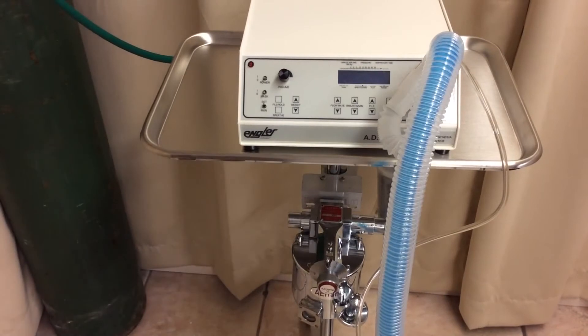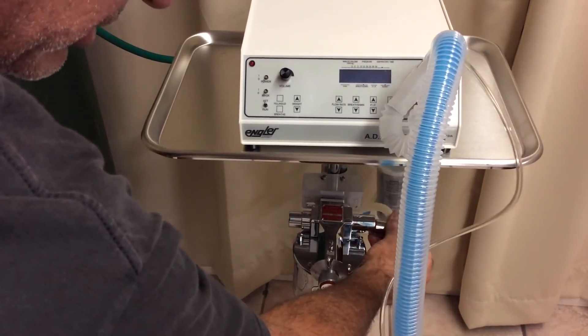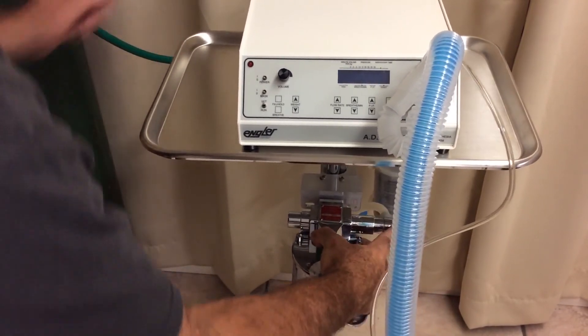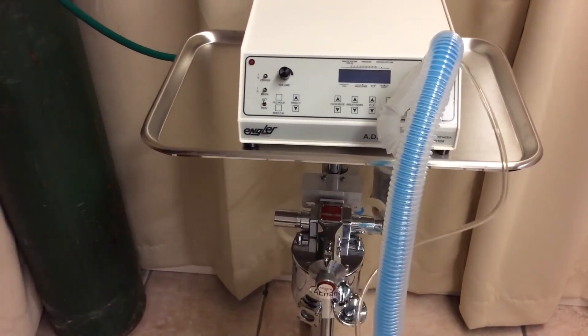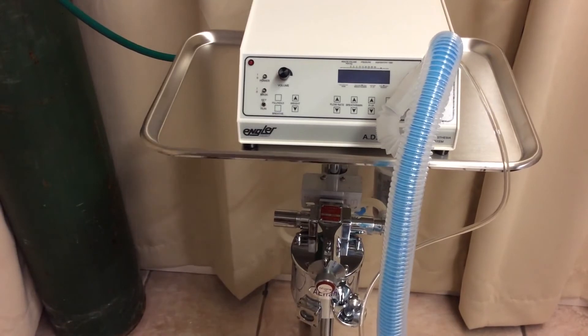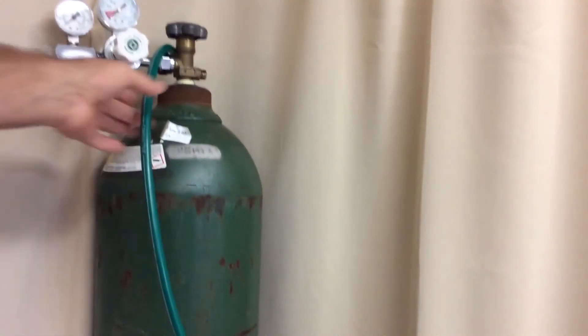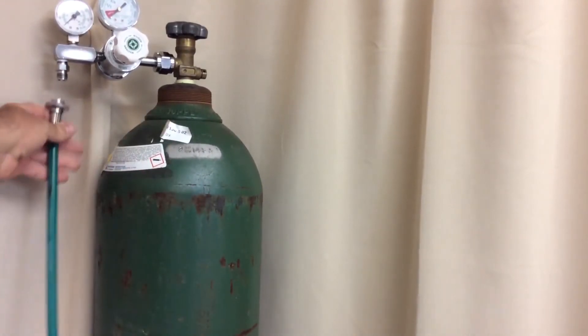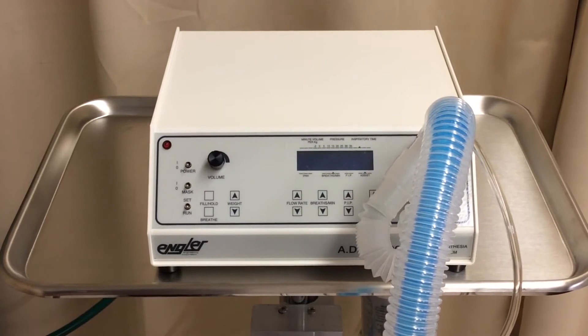Connecting the rest of the ADS is just as simple. Here we have the to and from vaporizer hoses — that connects here, and that connects here. Simple as that. And oxygen connects here as well.